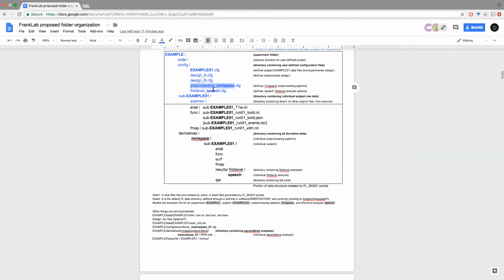But conceptually, the only thing that we need to do is get the proper processing pipeline to get our data in the proper space, which implies putting the functional and the structural data in coregistration with each other, then extracting the functional data from the cortical ribbon, and then running first level analysis just as we did for volumetric analysis.